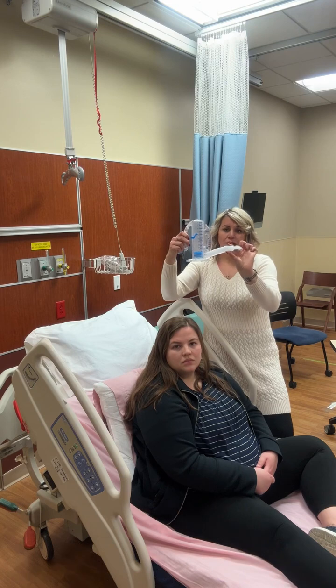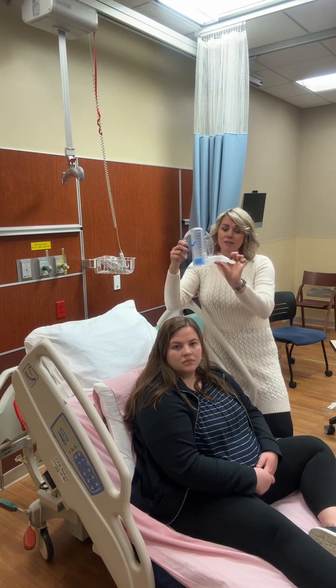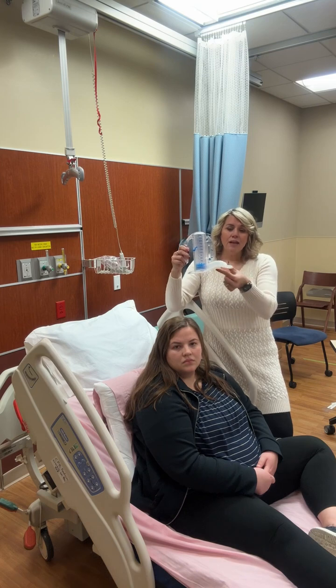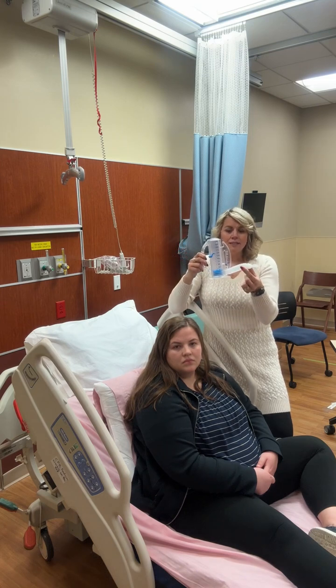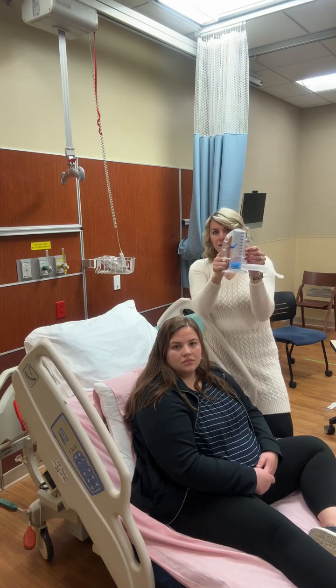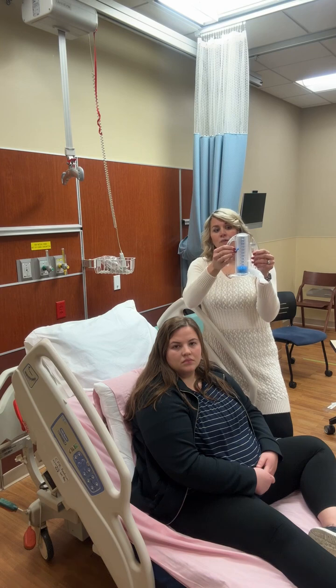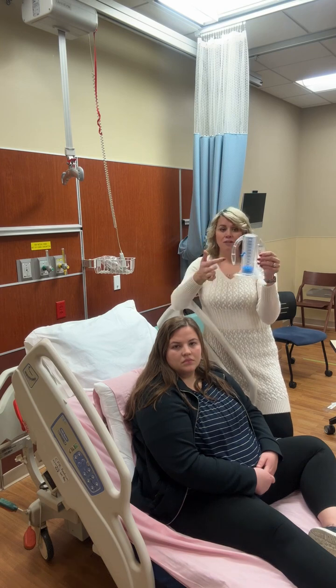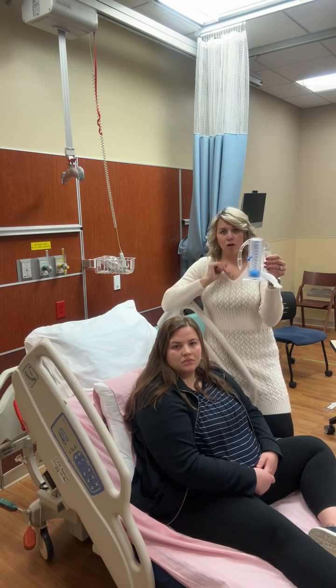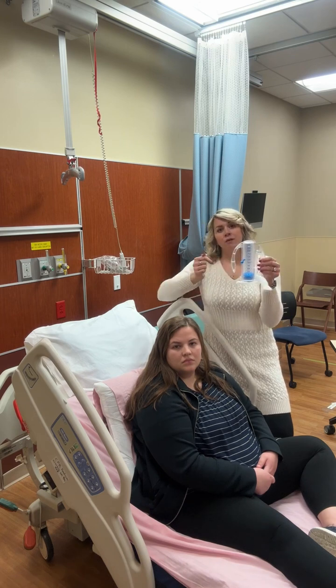So this tube here is the corrugated tubing. This is the dead space, same thing that was on the nebulizer. It allows the deep breath, and then the mouthpiece, all right? And so then you have the handle, this is the indicator that goes up and down to tell the patient, okay, we want to get to 1250. This shows them what you're looking for. This is the incentive, right? We want to hit that number right there.